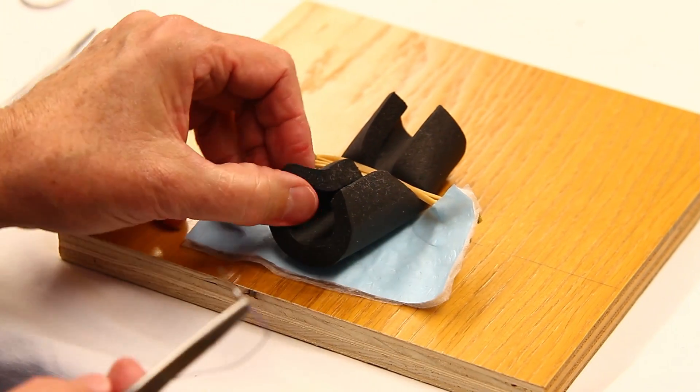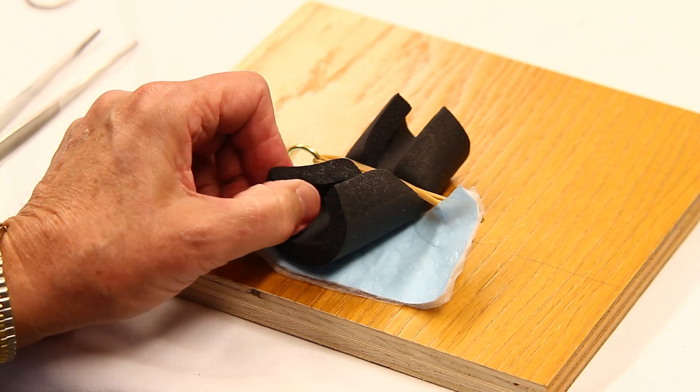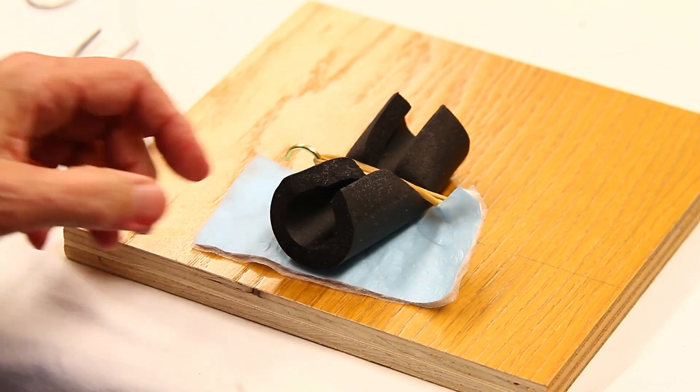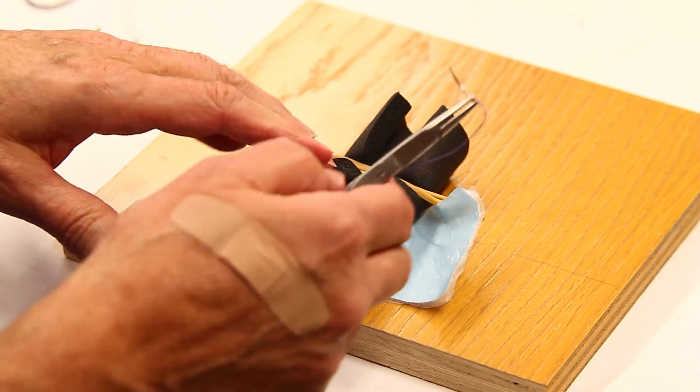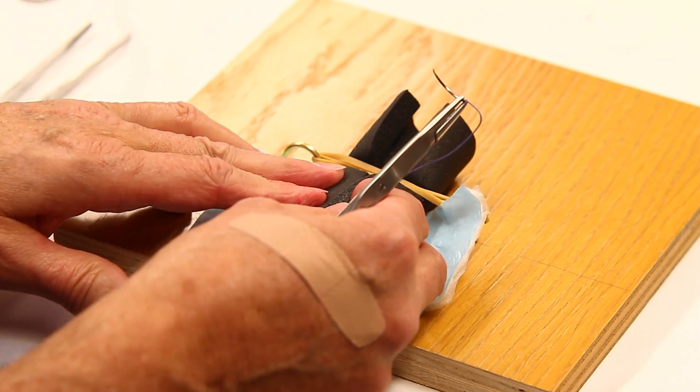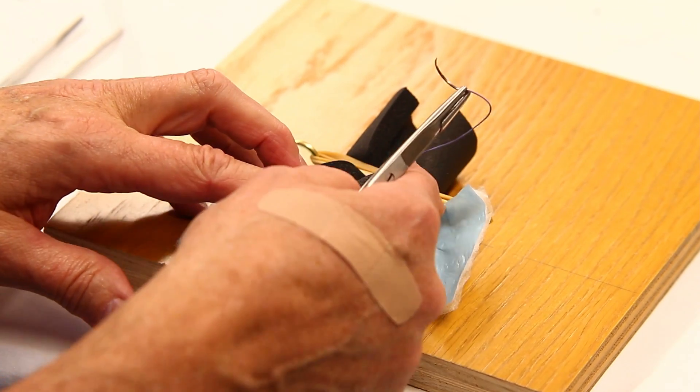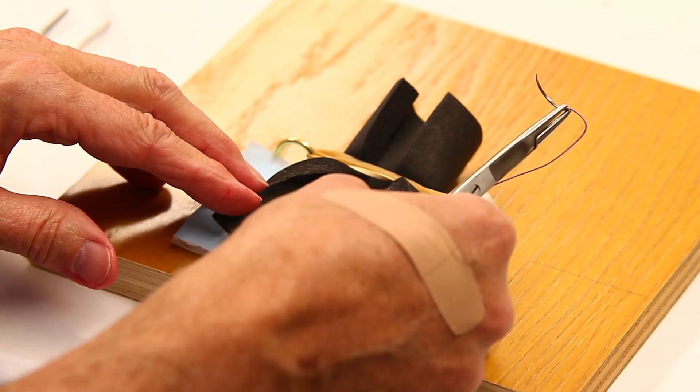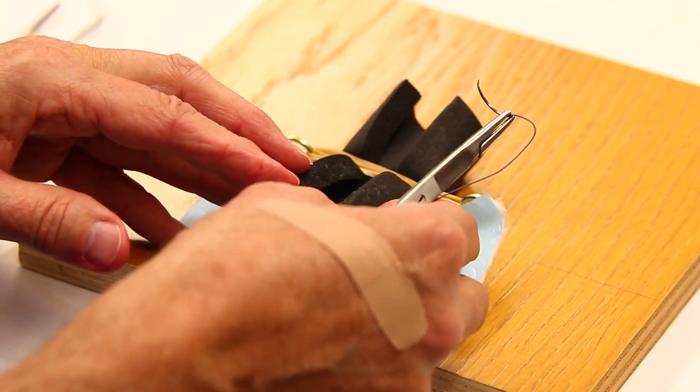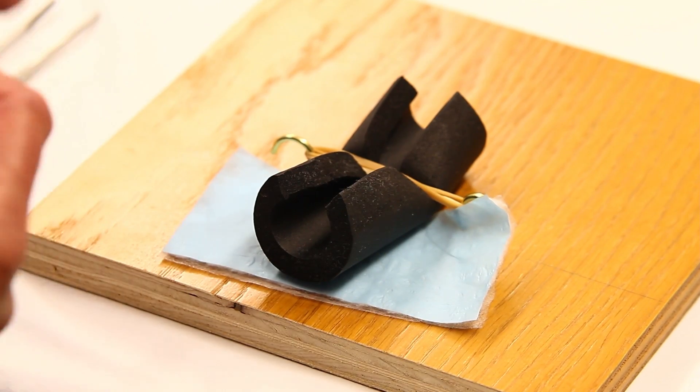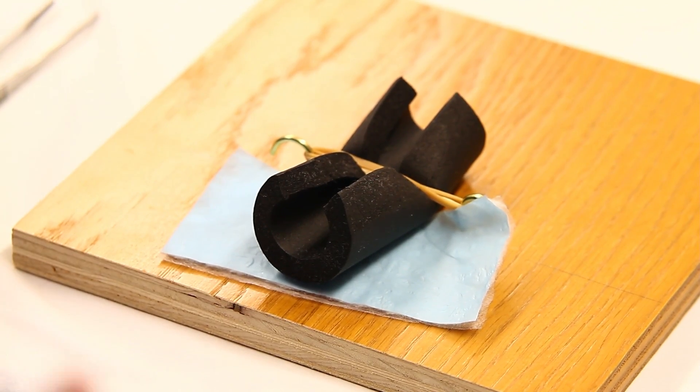It's the very spongy type that's commonly used for air conditioning lines rather than indoor water lines. The task is to close this laceration without penetrating either the outer lining or the inner lining. It's very delicate foam, so a light hand is required, and that's typical of the rectal wall.